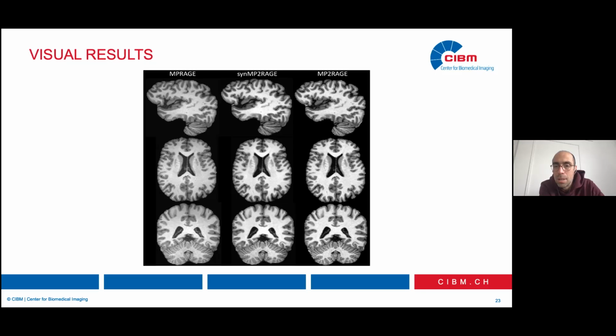On that note, why don't they always acquire MP2-RAGE, by the way? Why do they acquire MP-RAGE now? Don't ask me, I don't know. The acquisition itself is slightly longer, I think two minutes or something like that. But the time is not really the reason, I would say.